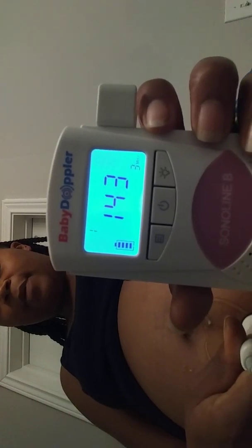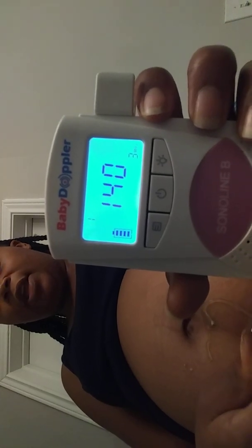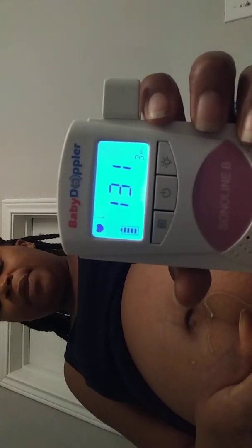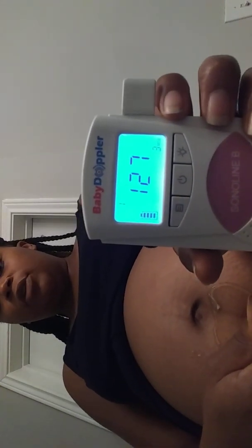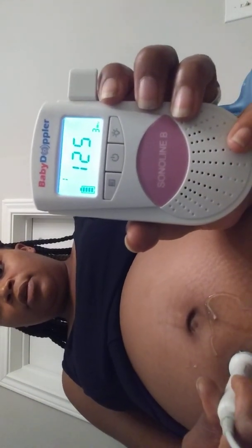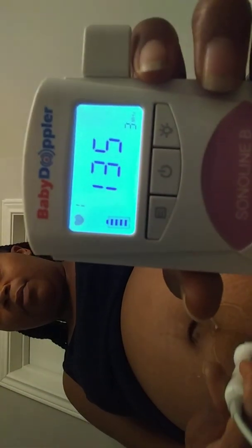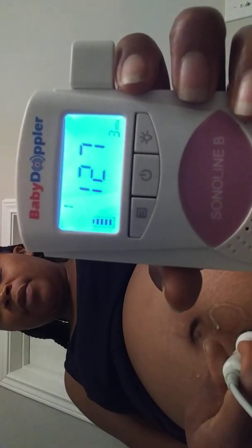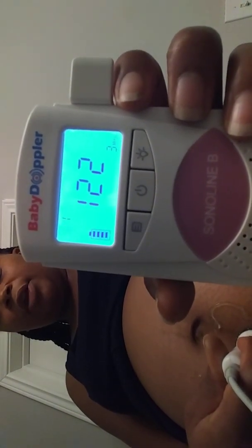My baby's heart rate is about between 145 and 150. One thing I found is that sometimes it's not as fast as your baby's actual heartbeat — it just picks up when the baby moves, so you kind of have to move with it. All those little sounds you hear are literally just the baby moving around trying to get away from it.